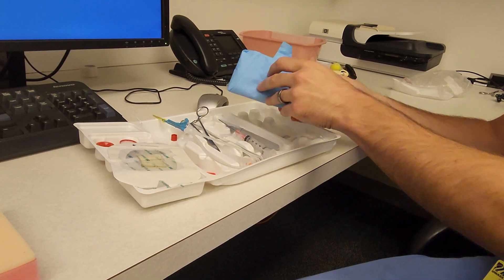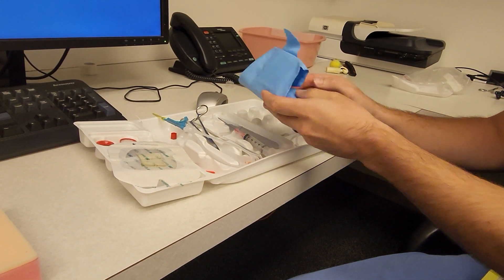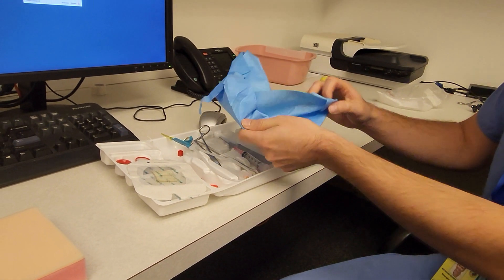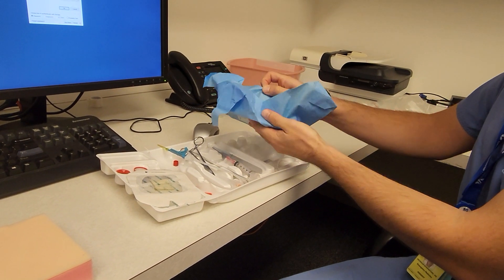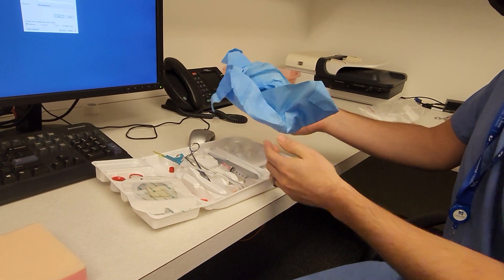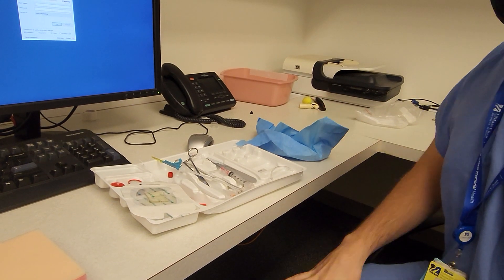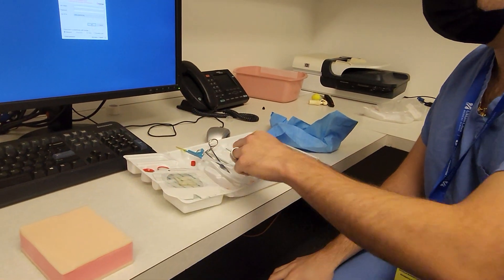You're going to use your probe cover on your ultrasound after sterilely preparing the patient and draping them.